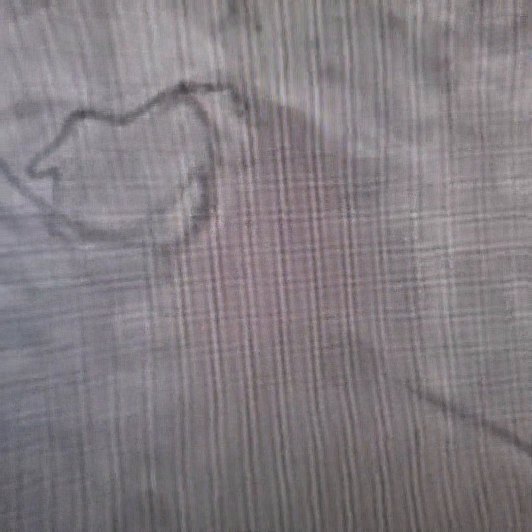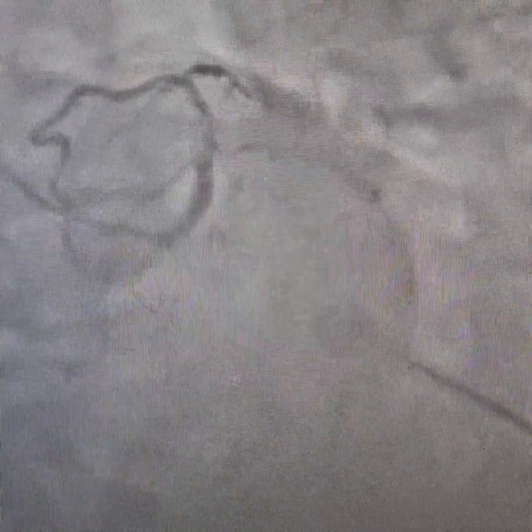This was the case of left main to LAD that we did recently. The patient presented with non-ST elevation MI and had severe chest pain on minimal exertion — he could not even walk to the washroom. You can see the LAD and the LCA are all diffusely diseased. The patient refused CABG, and the RCA is also diffusely diseased.